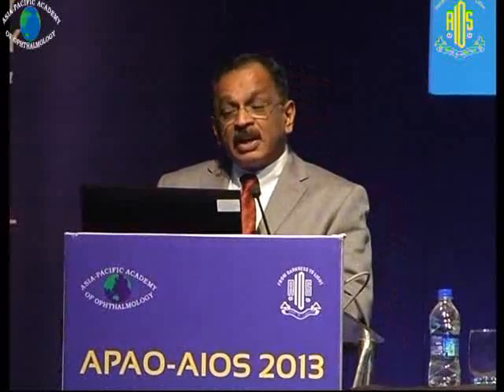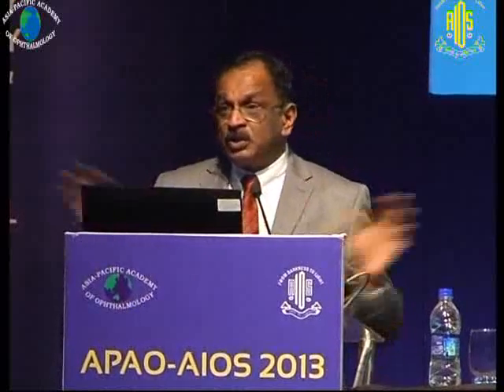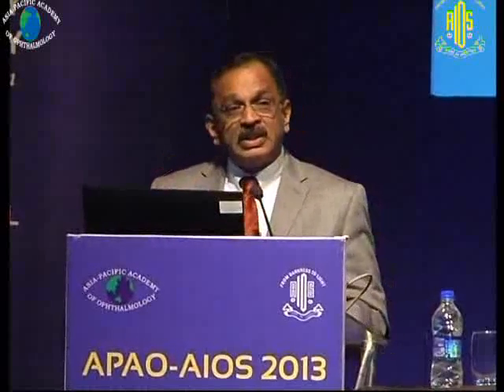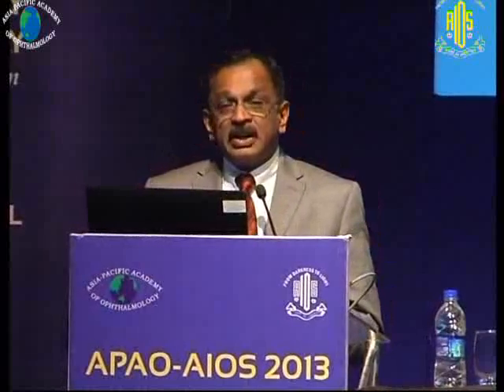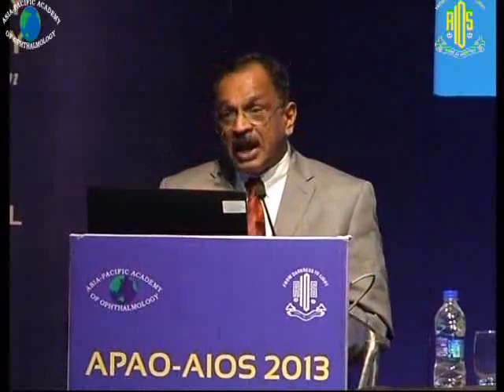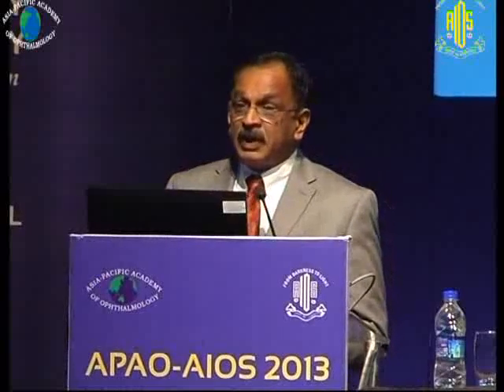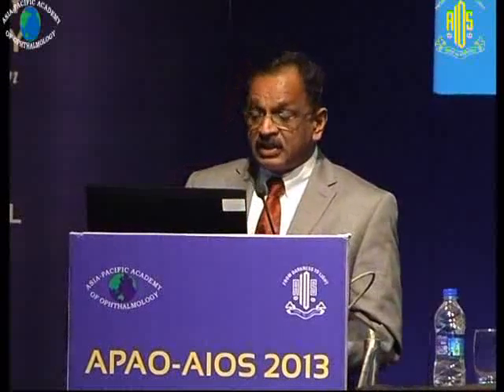When you have a napkin ring membrane around the disc, very often you flatten the retina, but you see the edges of the disc alone is elevated. Obviously there is some membrane that's holding the retina from flattening. You need to go behind the retina, maybe do an almost 180-degree retinectomy to access the space to remove this membrane. Otherwise the retina is not going to flatten.